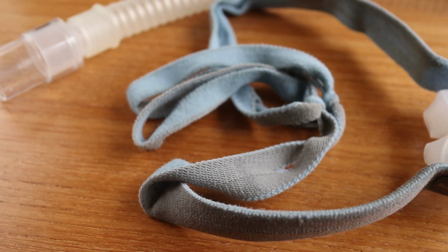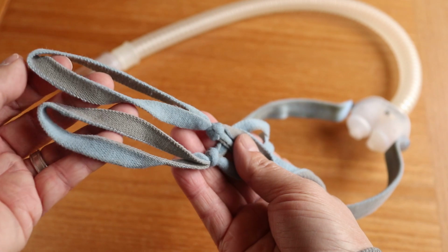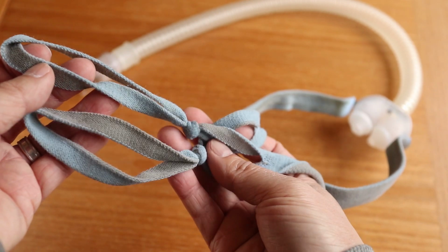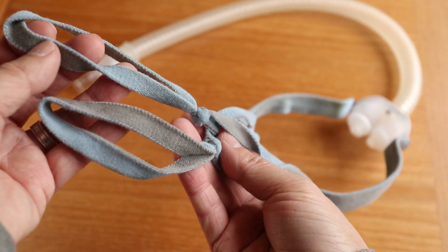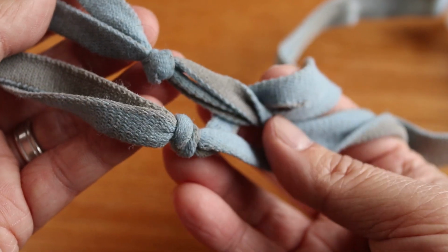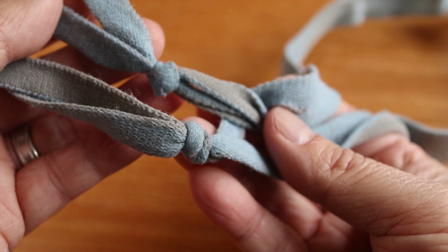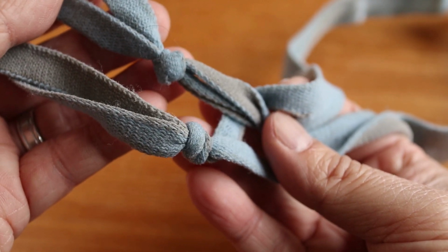The CPAP headband on my ResMed AirFit P10 nosepiece is extremely worn out. And in this video I'll show you step by step how to replace this to make it feel like new again. My old elastic band is so stretched out that I've had to tie it off multiple times just to make it stay on my head. I actually should have replaced this long ago. So let me show you how to change this out.